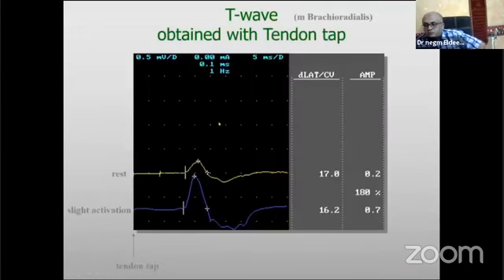We also have one more thing regarding reflexes, and that is in some laboratories they use so-called T waves. That is the patellar reflex that you not only look at, but you record the response from the quadriceps femoris. And here is at rest, where you get the small response, and with slight activation, you get the facilitation and much higher amplitude and a little shorter latency. This can be done in any muscle where you do your studies with the reflex hammer.